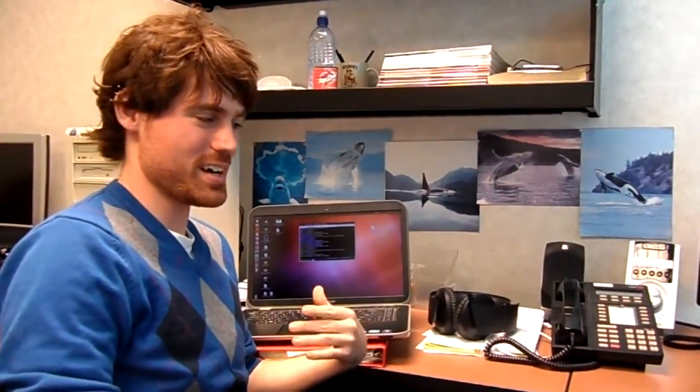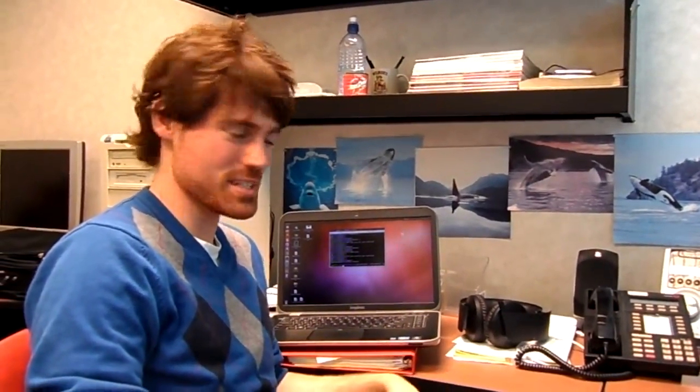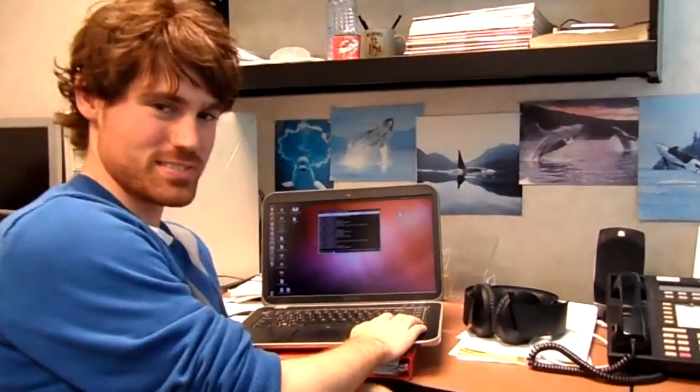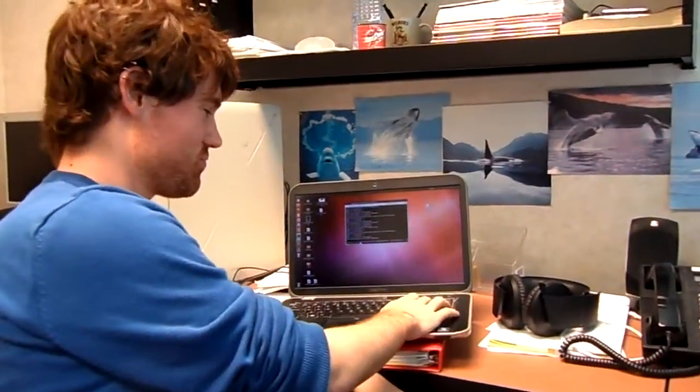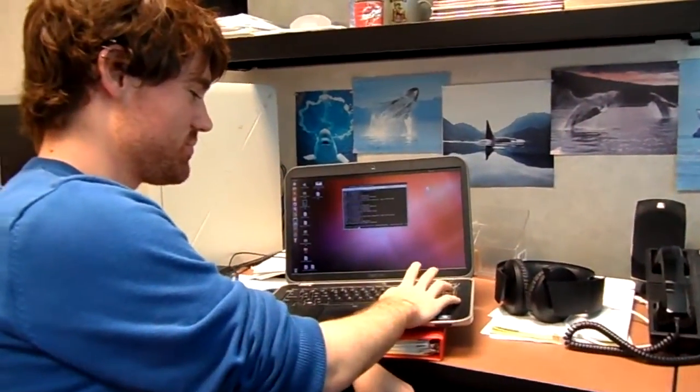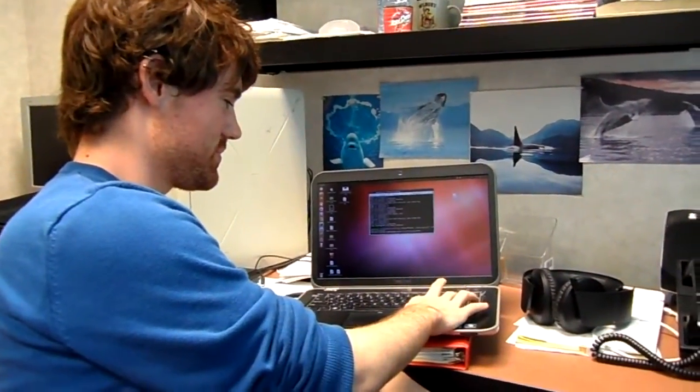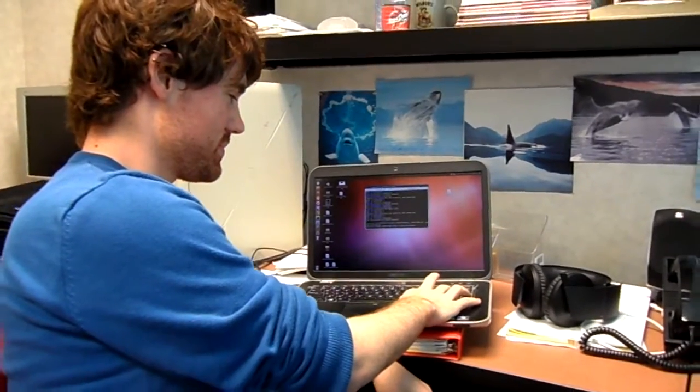Today we're going to do a demonstration of the biograph or biopack graphing application for the tablet. To start, we're going to start up the acknowledge server with the biopack daemon.